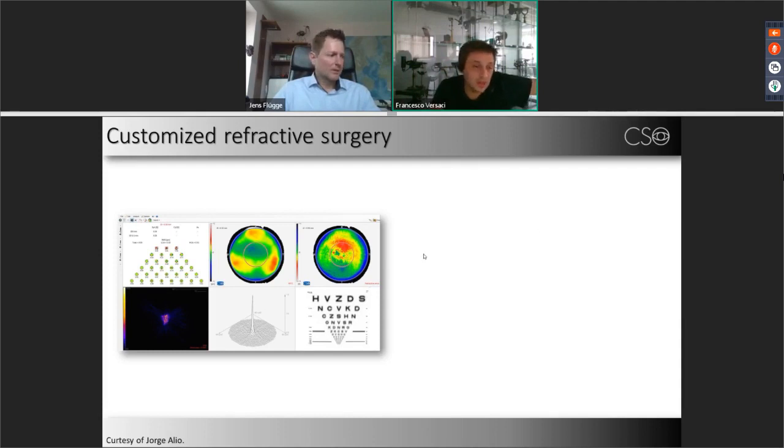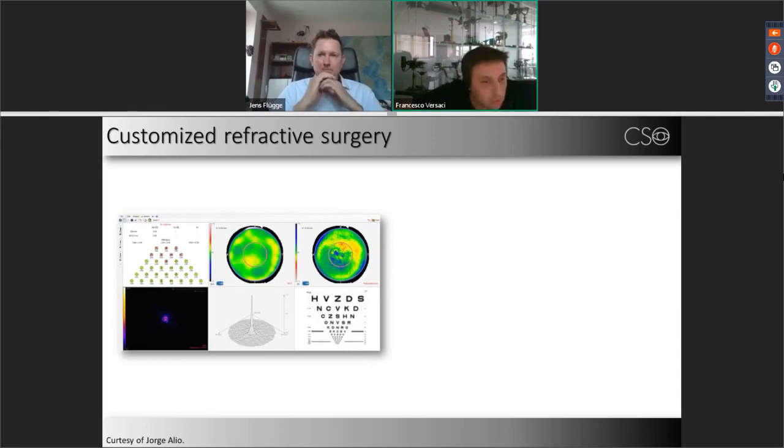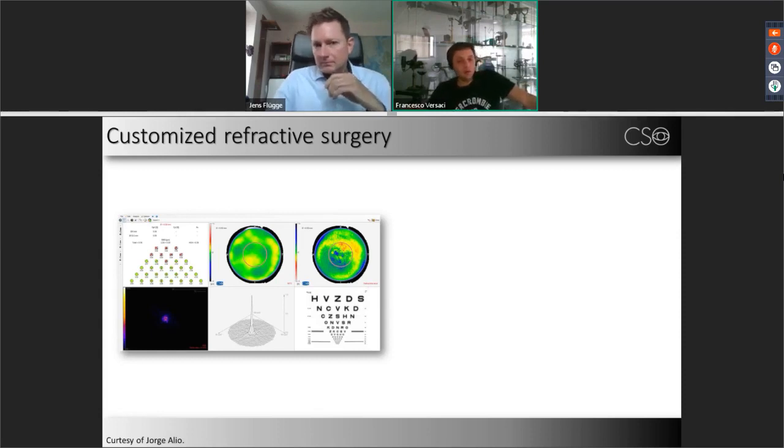So the surgeon decided to remove some of the high order aberration polynomial. So he ended up choosing to remove the spherical aberration and all the third order, and evaluate that the quality of the vision was good enough, and also the wavefront was planar enough.